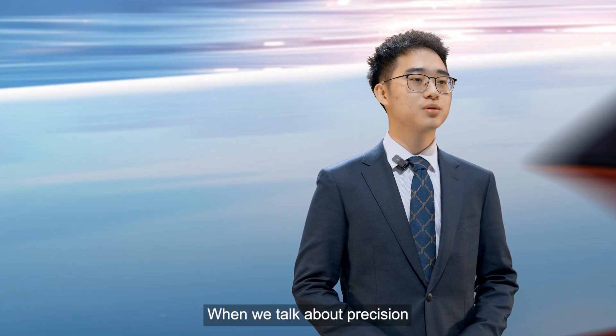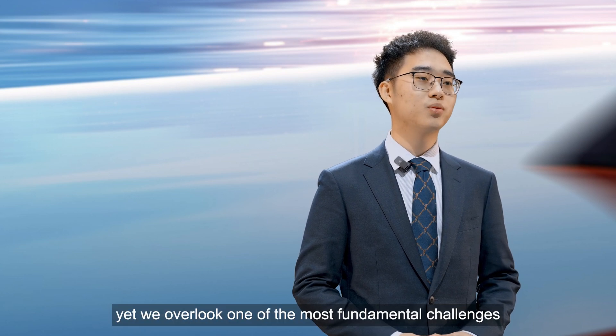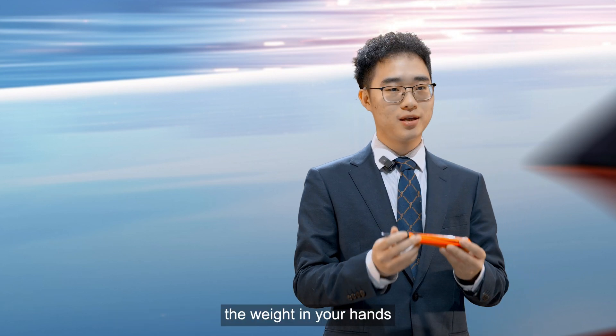When we talk about precision, we often focus on parameters and algorithms. Yet we overlook one of the most fundamental challenges: the weight in your hands.